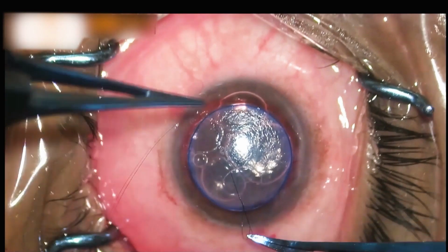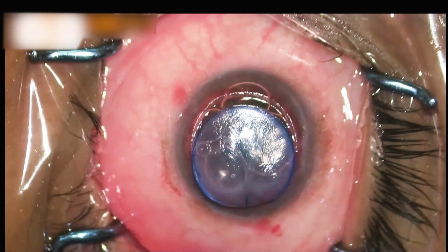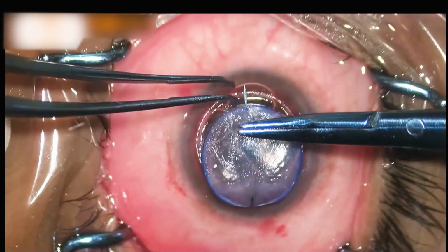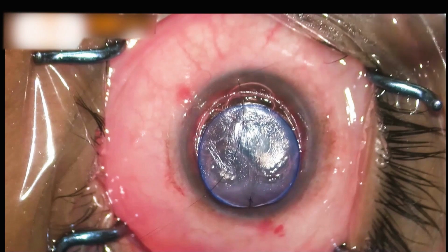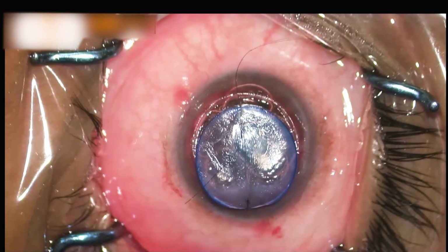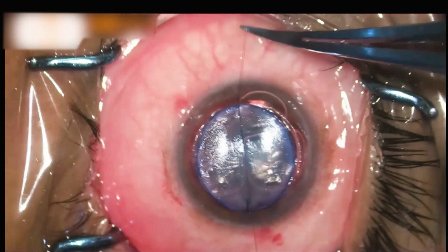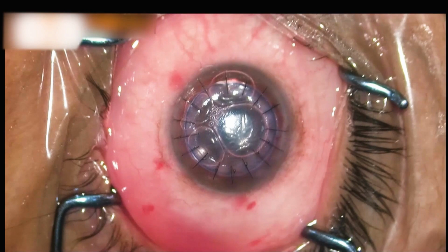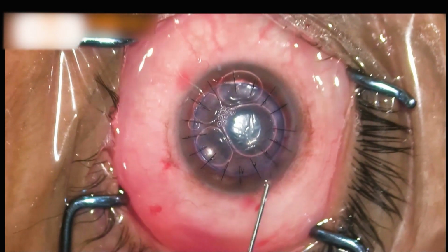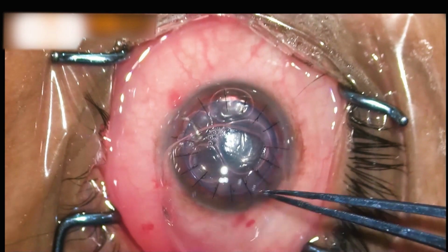The graft is then sutured to the host cornea using 10-0 nylon. Four interrupted cardinal sutures are placed, followed by placement of the rest of the 12 sutures at equidistance.